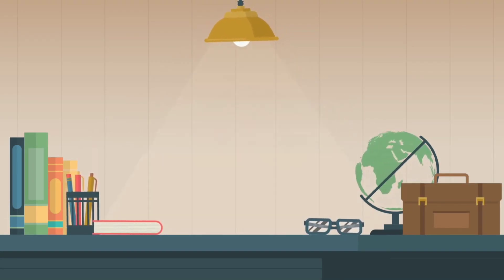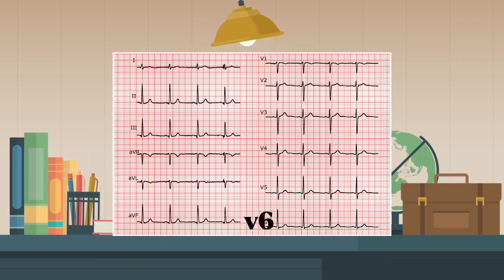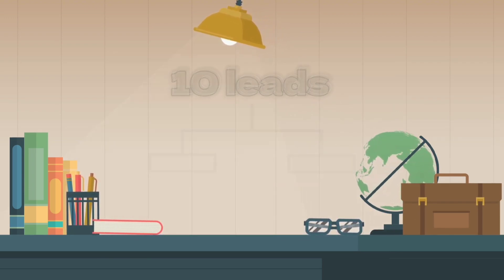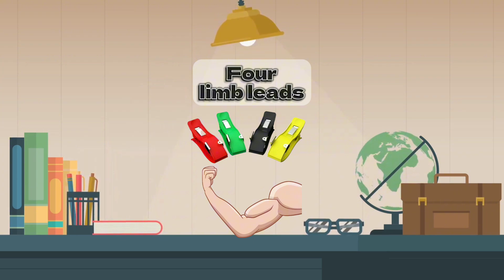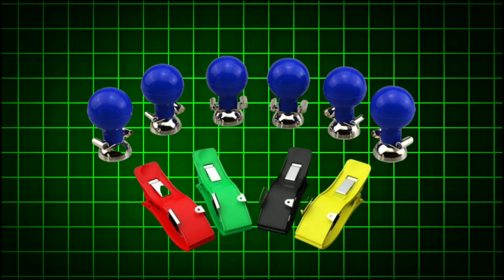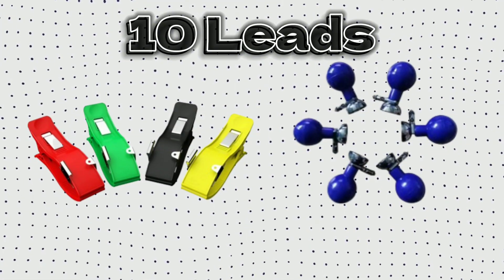In this video, we will learn lead placement for 12-lead ECG. For that, we will need 10 leads, which are of 2 types: 4 leads for limbs and 6 leads for the chest. These 10 leads will give us a 12-lead ECG. These 10 leads are 10 electrodes.